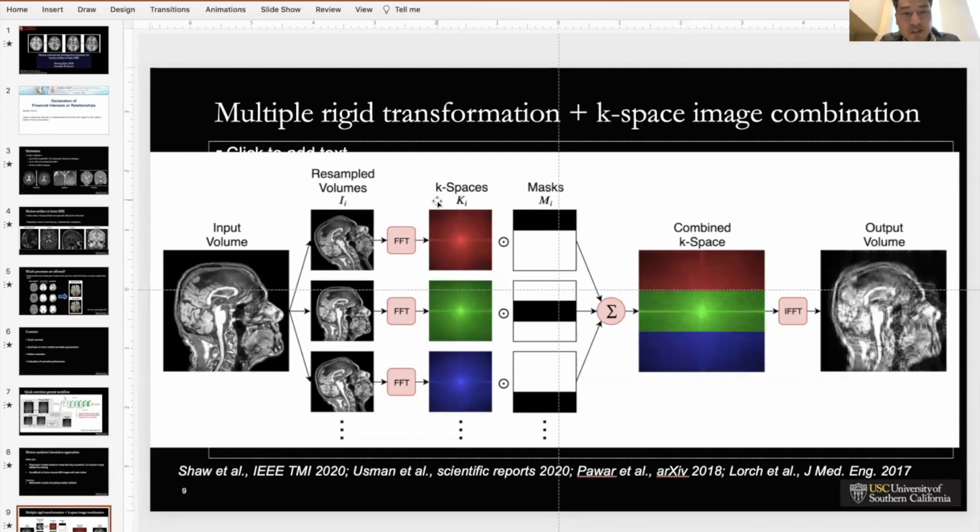You can obtain k-space data like that, and you place the original data in the middle and other data in other parts. If you have more data and more transformations, you can proportionally change them. They are the region of interest, and then you combine them within the k-space. Then at the end, after inverse transformation, the data looks like data with actual realistic motion.